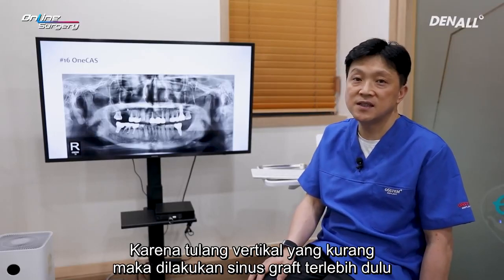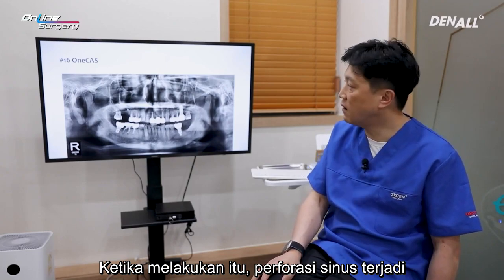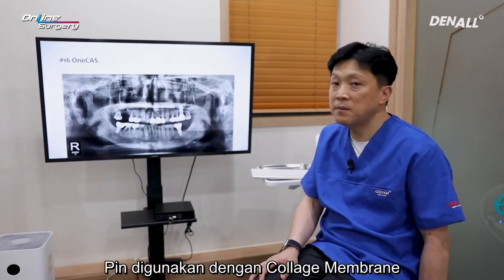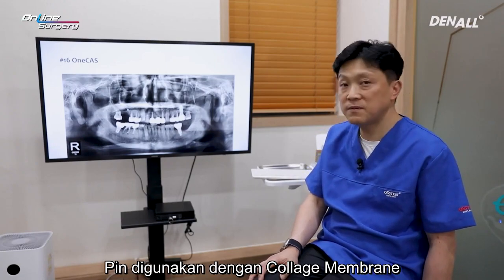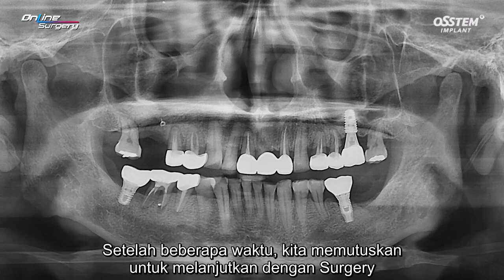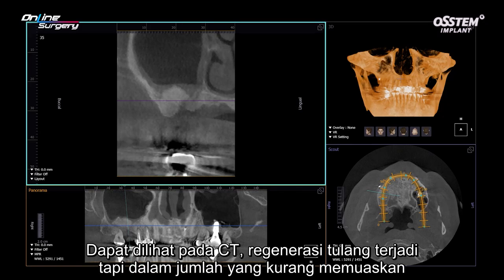Because there was a lack of vertical bone height, the sinus graft was done first. As I was performing that, sinus perforation occurred. A pin was used with a collagen membrane to manage the sinus perforation, and bone graft was performed. After a certain period, we decided to go with this surgery under the premise that there has been a certain level of regeneration. On CT, there is not a satisfactory amount of vertical bone regeneration.